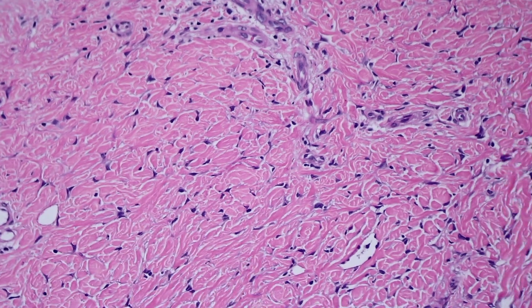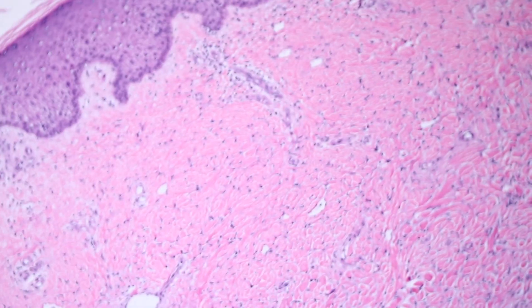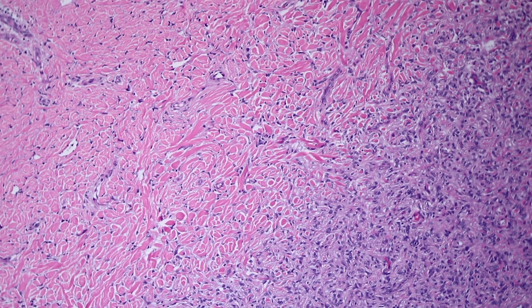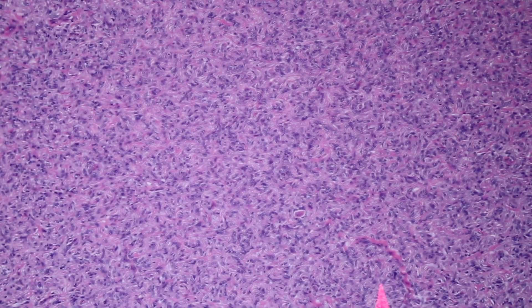That's a very characteristic pattern for Dermatofibroma - to see even a little area of this. If you go to the middle of this lesion it looks quite different, and that's the key: look at the edge, look at the periphery. The low-power view and the periphery of the spindle cell infiltrate as it interfaces with normal dermis is a really helpful way to confirm that something is a Dermatofibroma.